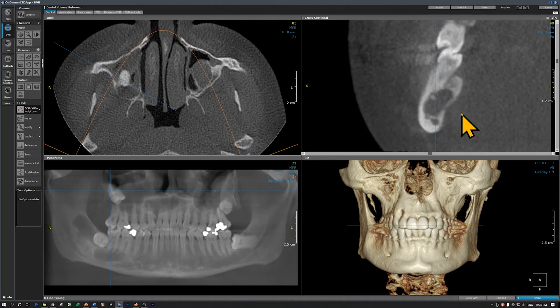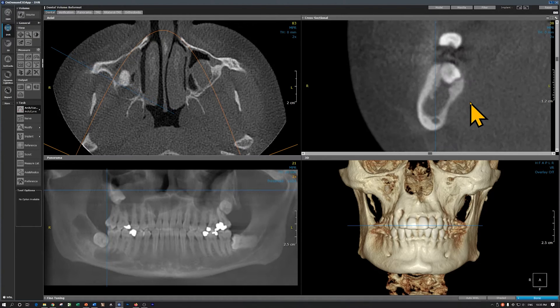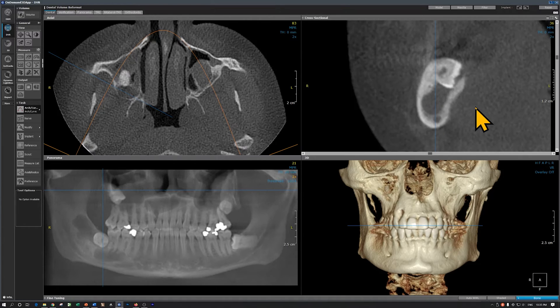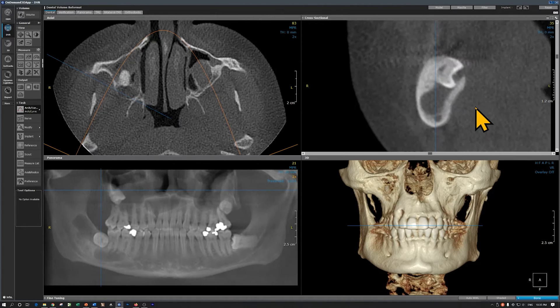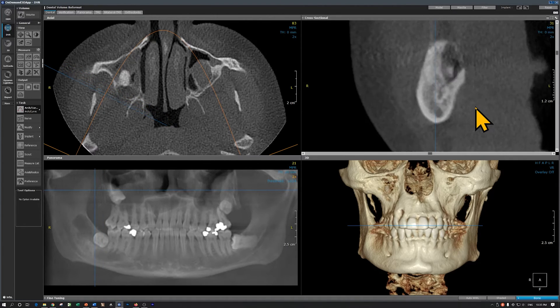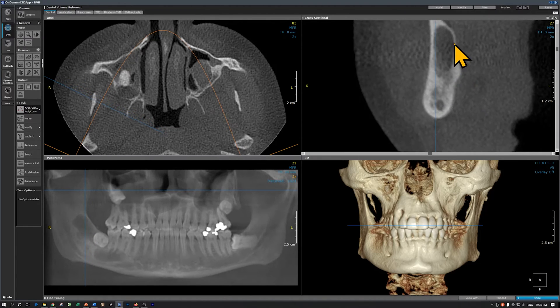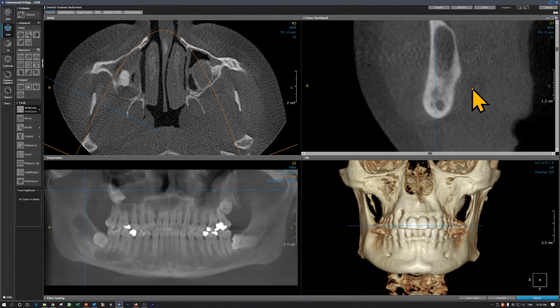Going further distally, we are in the second molar area and then the third molar. Again it's a long cystic lesion. This is the inferior alveolar canal. There's no expansion of the buccal or the lingual cortical plate. Further distally, this is in the ramus and again we see the lesion. Vertically long, buccally to lingually, there's not much expansion.